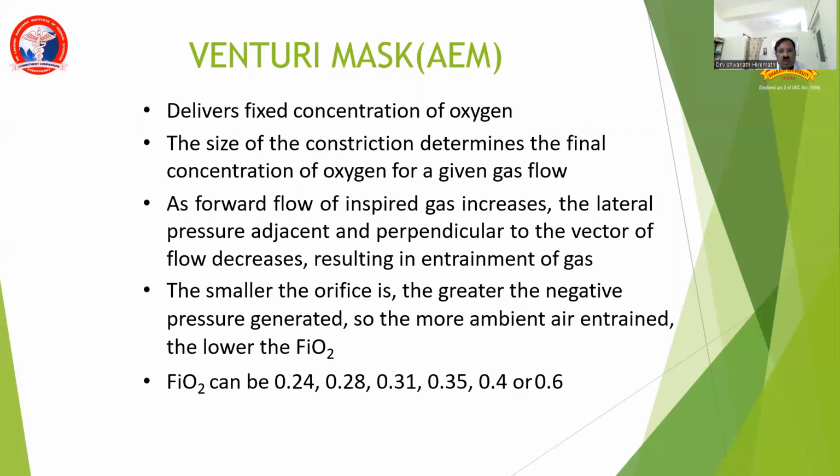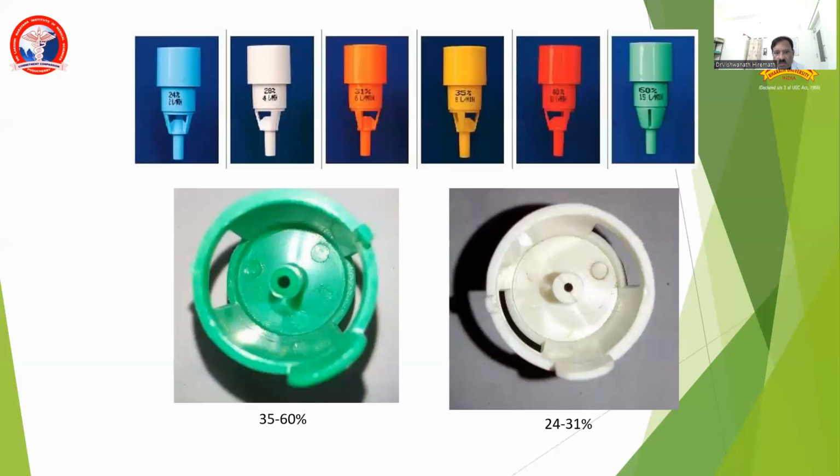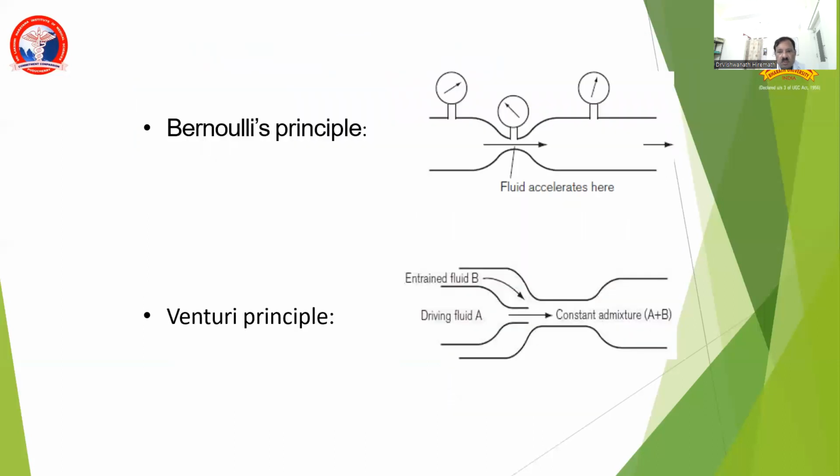A forward flow of the inspired gas increases the pressure gradient, and the flow rate increases.